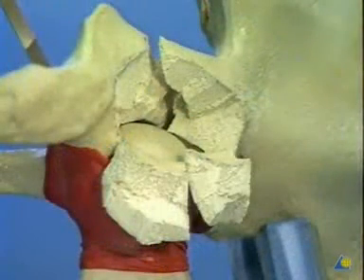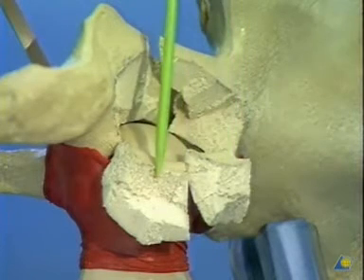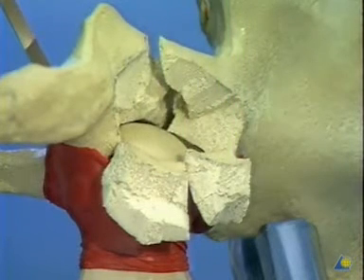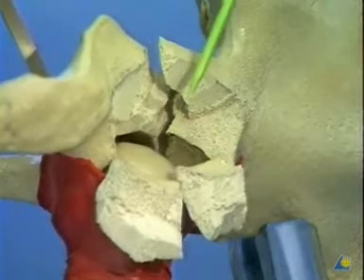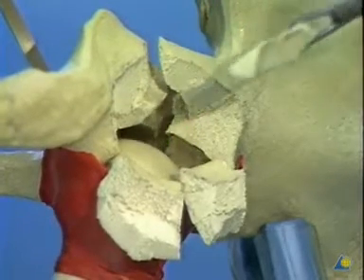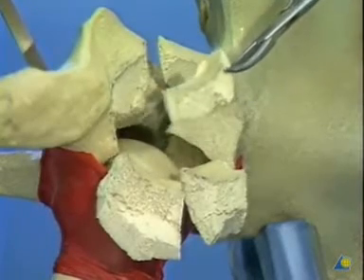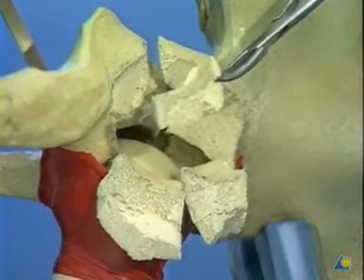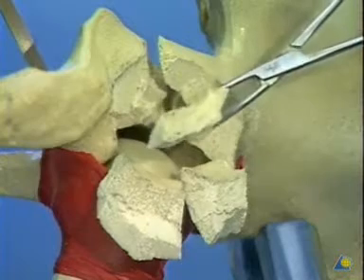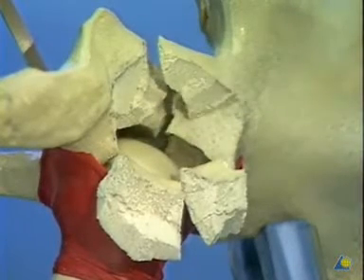Seen on the close-up is a transverse plus posterior wall fracture with a posterior wall fragment remaining attached to the hip capsule. This injury typically is associated with a posterior dislocation of the femoral head. During the surgical approach, a free bone fragment of cancellous bone, covered partially by articular cartilage, was found in the wound. This fragment must be included in the final reconstruction.